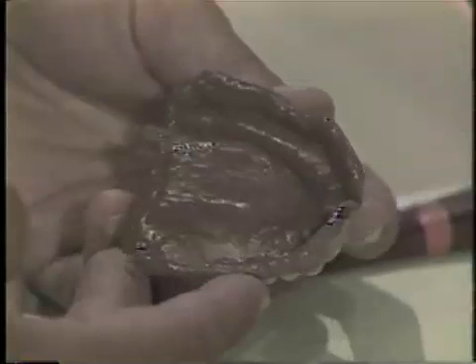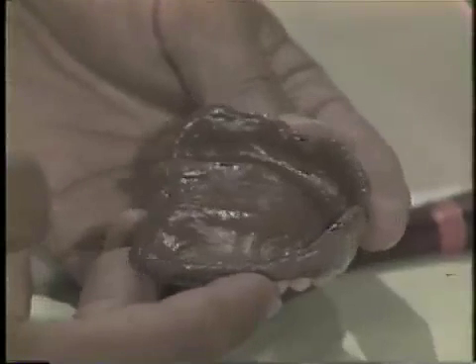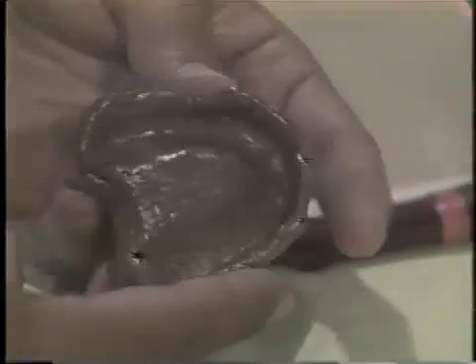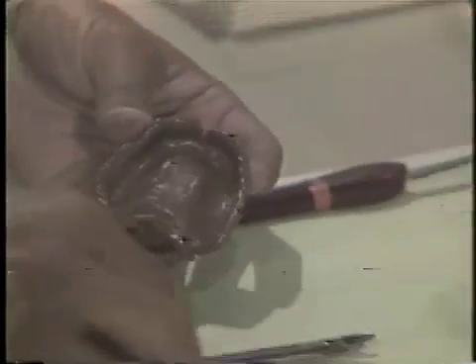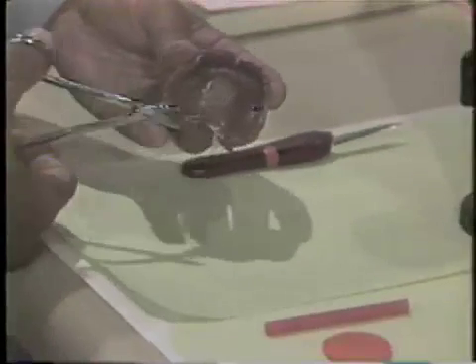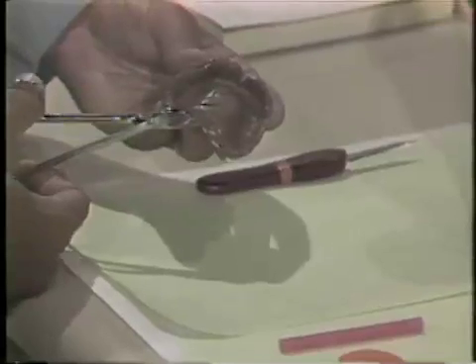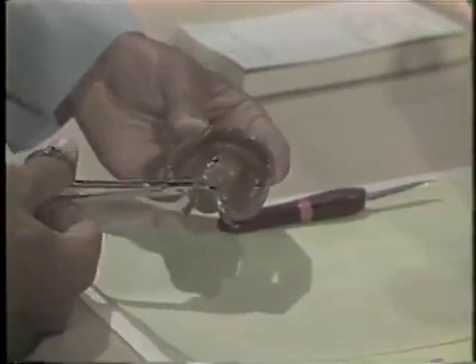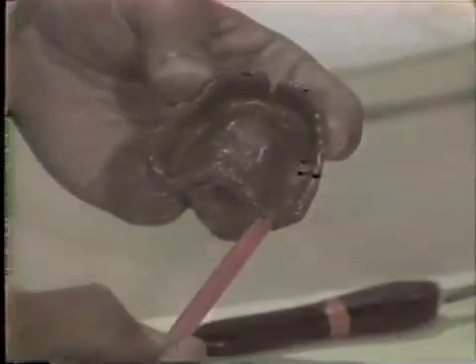When the impression material has set, remove the denture from the patient's mouth and check the impression for bubbles and flaws. Once the impression is accepted, the posterior border should be reduced to its predetermined length with a sharp scalpel or scissors.